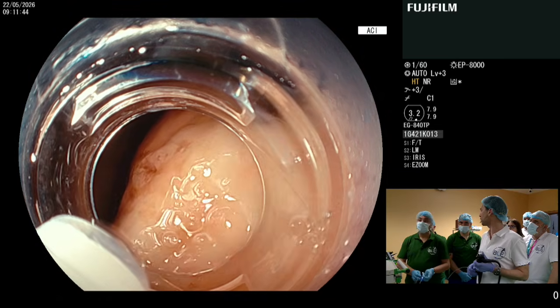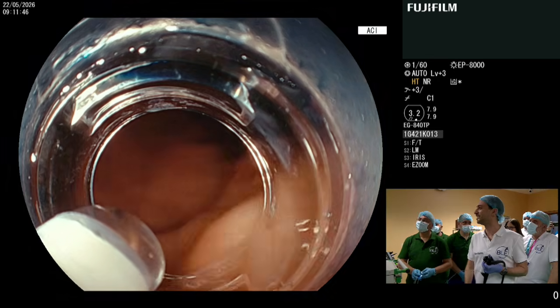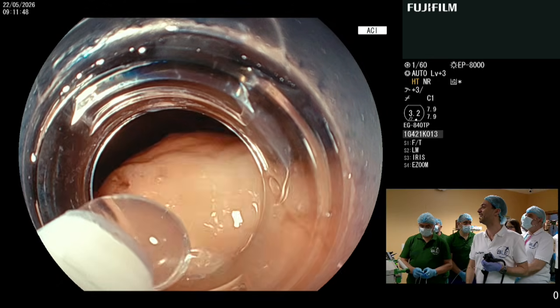We have a surgeon as a backup? No. No. You're very confident.